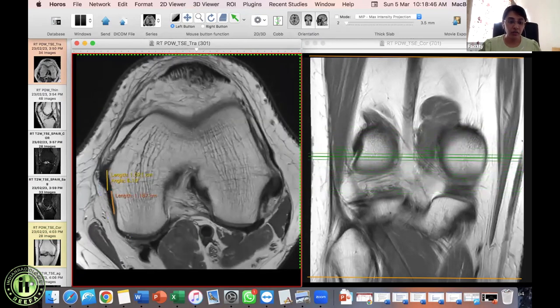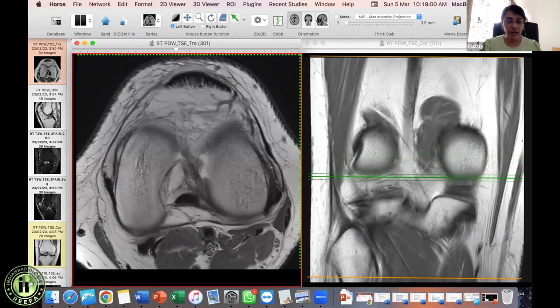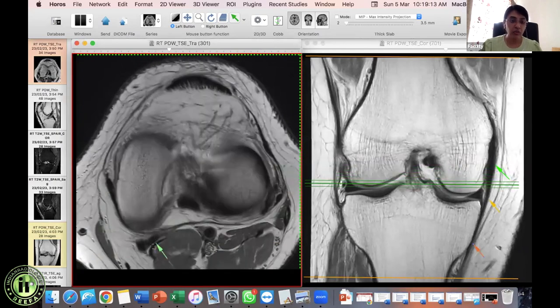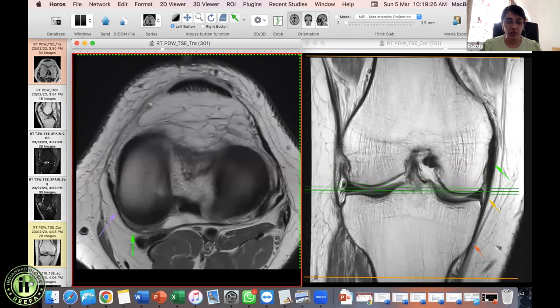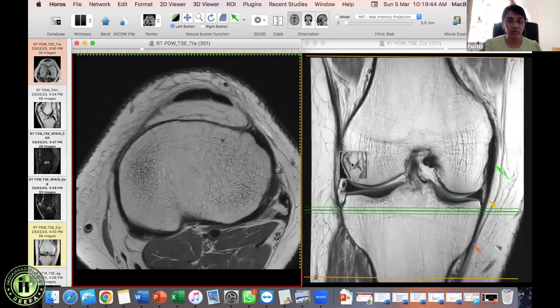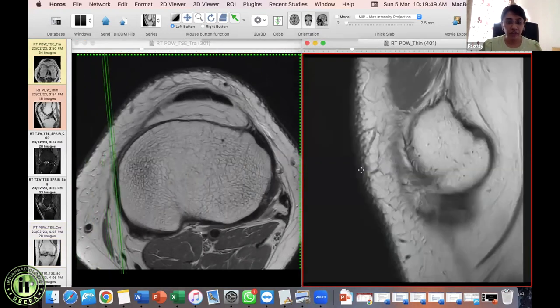Identifying the semimembranosus: the medial gastrocnemius and then the semimembranosus tendon are visible. Going inferiorly, about a centimeter above the joint line, a small black structure separates from the semimembranosus — this is the capsular arm, going toward the capsule. As you go inferiorly the main tendon and capsular arm are both visible. The anterior and direct arms are not well differentiated on MRI, as previously mentioned, but let's try to identify what we can.